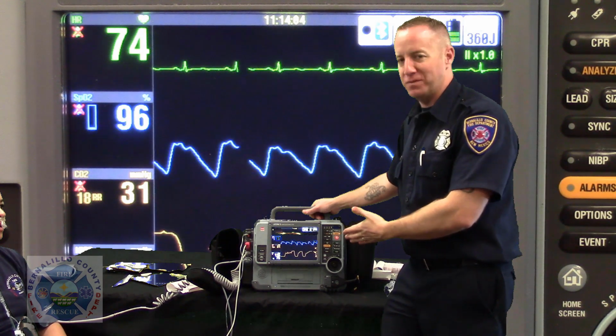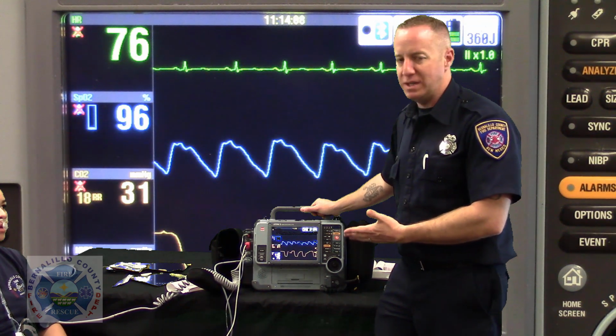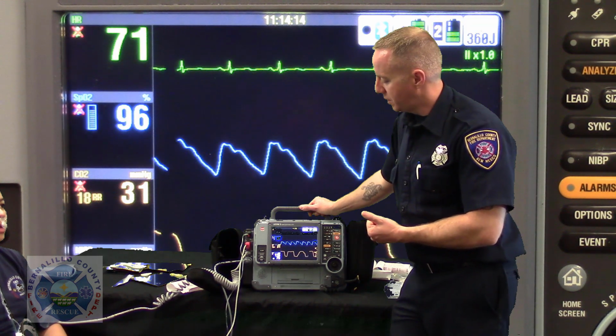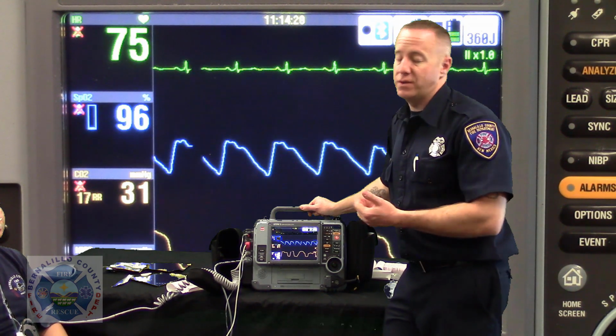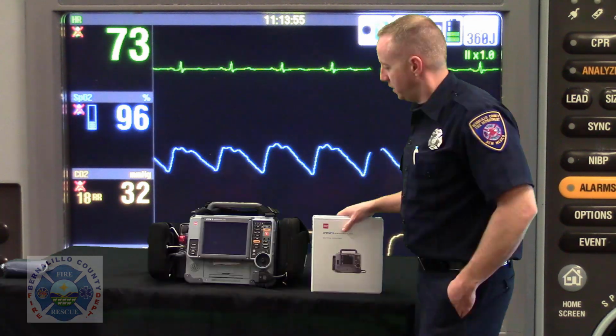I'm going to go over the Lifepack15 for you so you understand the features and maybe some key steps on how to deploy it for your patient assessment and how to do it efficiently. And so what this thing will do for you is make your patient interactions that much more beneficial for your patient and for you later. We'll talk about all those considerations. So thank you for joining me today.